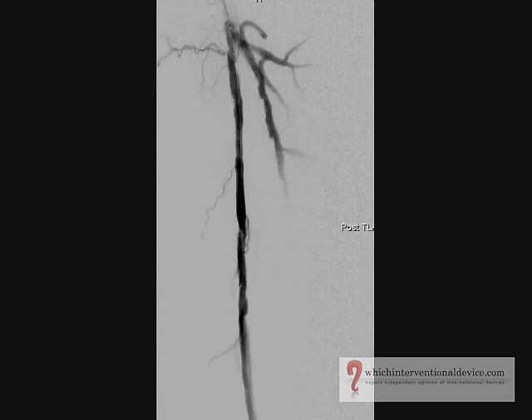Following this the balloon is deflated, the wire is left in situ, and good angiographic flow is demonstrated.